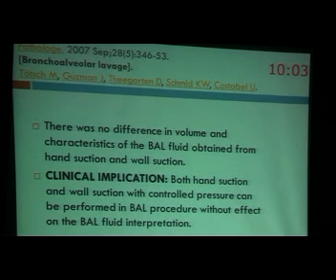نعمل hand suction ولا نعمل wall suction؟ في بيبر طلع طبعا مشهورة ان الحكاية مش فرق. الحكاية بس بقى البريشر او النيجاتيف بريشر بنستخدمه اوبتمايز. انما لما شافوا الانتربريتيشن بتاع البرونكو ارجوال سيلز او بتاع الريكفري وين البرونكو ارجوال سيلز او مينرالز او وات ايفر او مايكروبيولوجي، ما فرقتش اذا كان وول سكشن او اذا كان هاند سكشن.